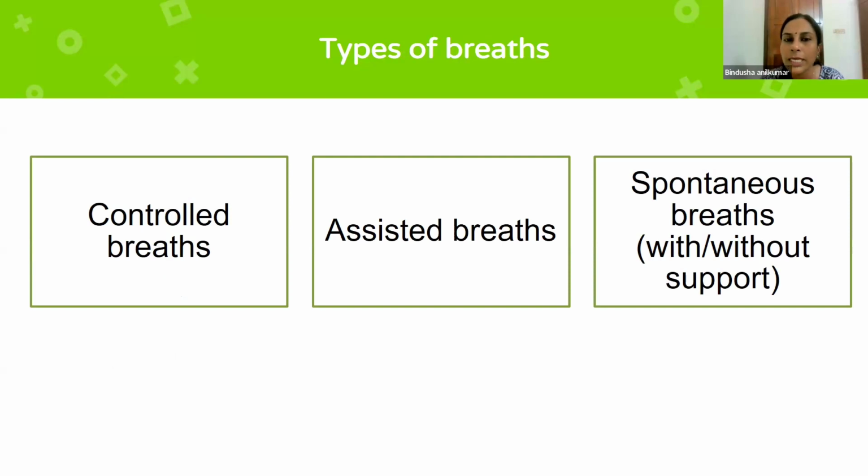Controlled breath is a breath which is initiated by the ventilator itself. It's not initiated by the patient. It's initiated by the ventilator. And the ventilator is the one which will determine the inspiratory time. And also the ventilator is the one which will give the tidal volume or pressure. So it is fully controlled by the ventilator.